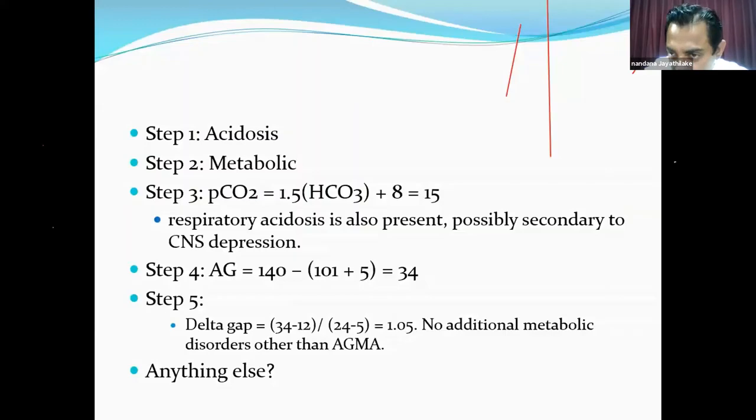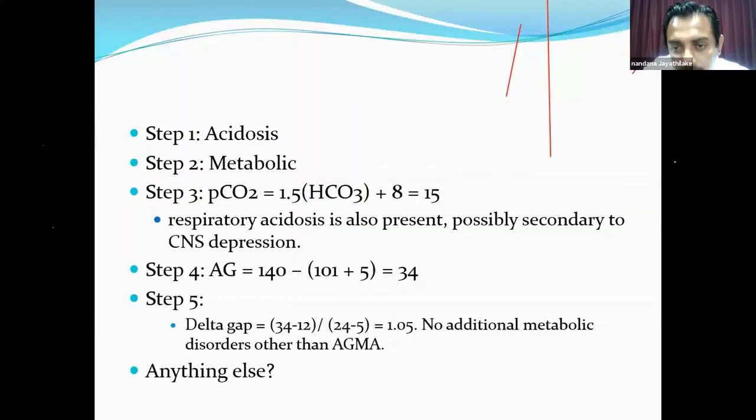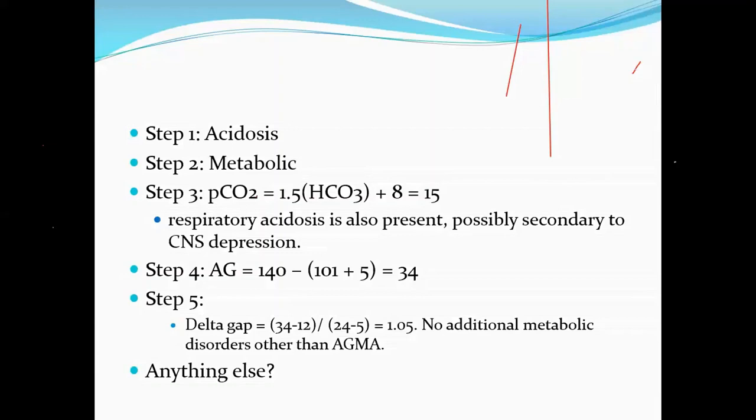What else do you need to know? The patient's serum albumin level. Excellent, we need to know the patient's serum albumin level. Very good. Another one: blood glucose level.